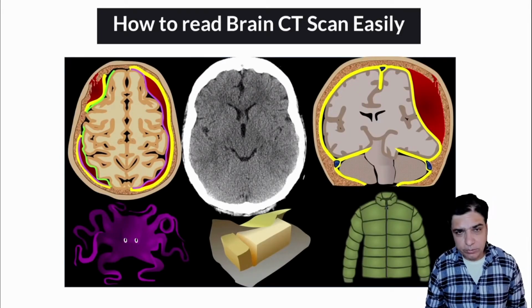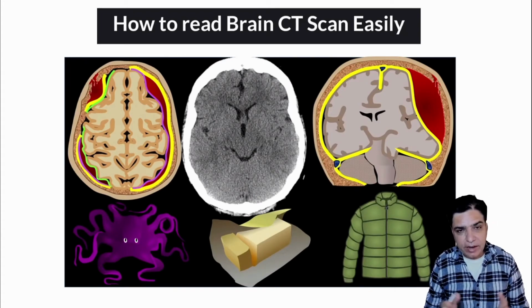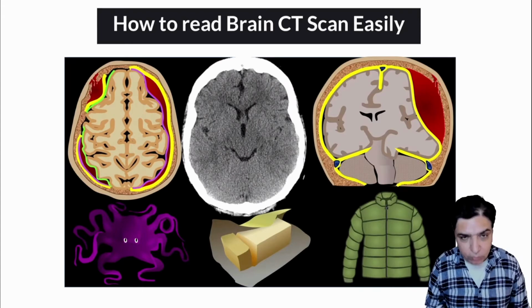And today we will be talking about how to read the brain CT scan in an easy and digestible format.